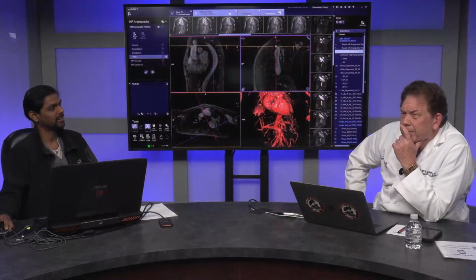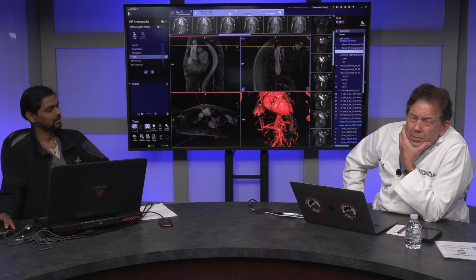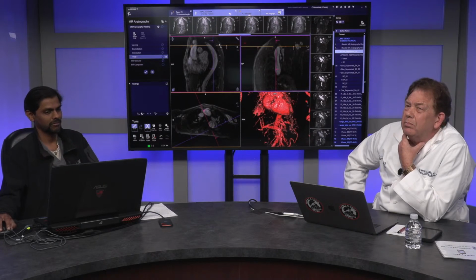Maybe you would have known that when the patient is in the OR with IVUS imaging, you will be able to figure out if there is no entry tear, and the first entry tear is more in the infrarenal aorta at the level of the visceral vessels.